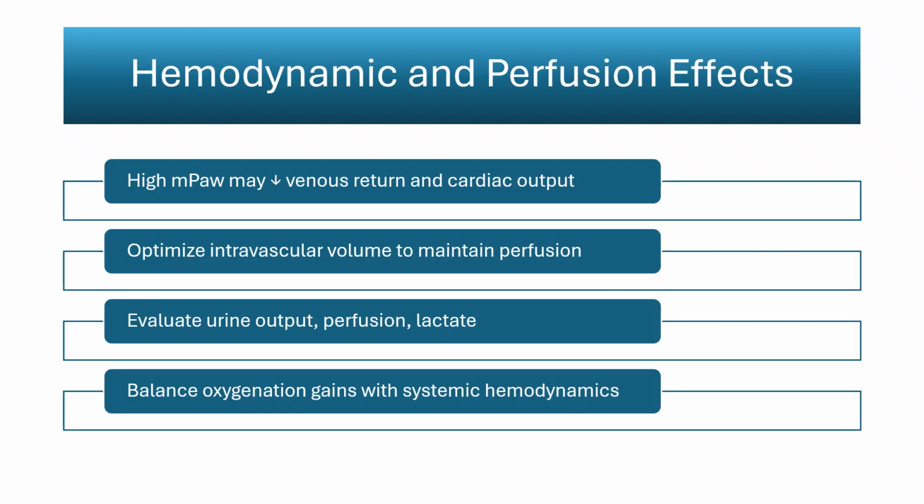High-frequency ventilation alters the normal interaction between ventilation and circulation. The sustained mean airway pressure that keeps alveoli open also increases intrathoracic pressure, which can reduce venous return and cardiac output if set above the optimal level. This effect is more pronounced in hypovolemic or preterm infants with limited myocardial reserve. Maintaining adequate intravascular volume and careful adjustment of mean pressure prevent this secondary cardiovascular compromise.